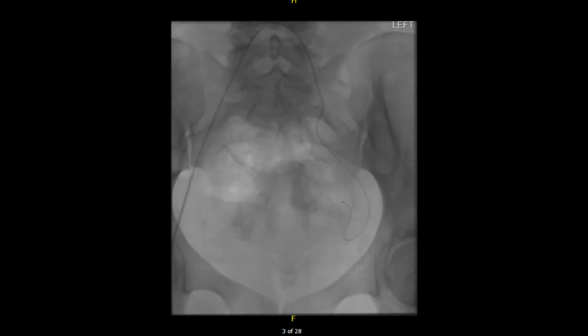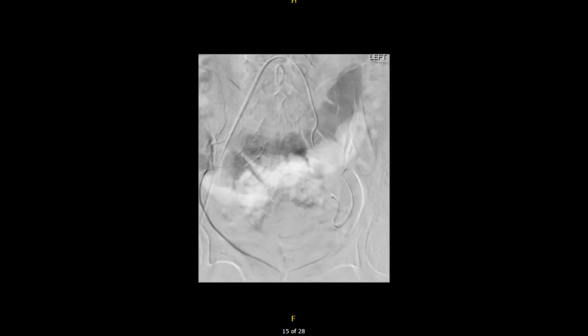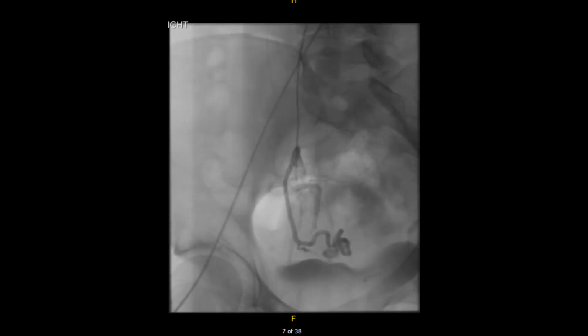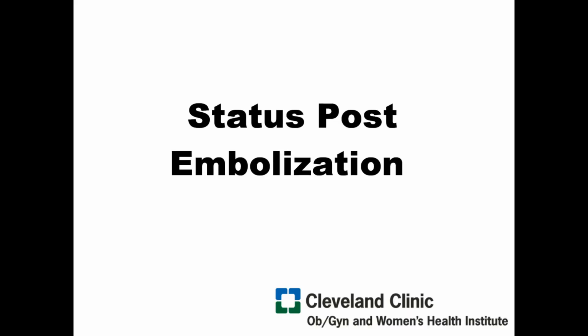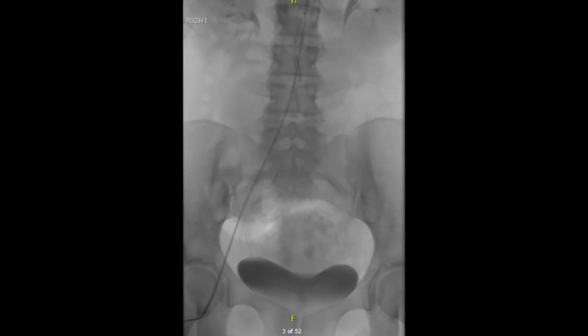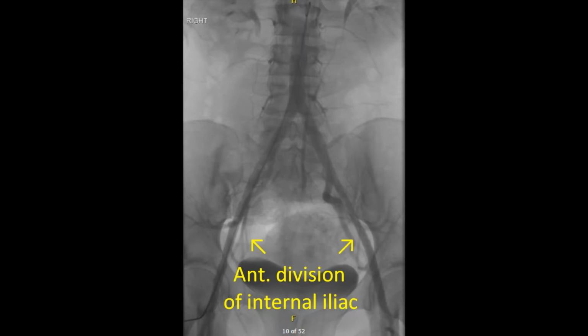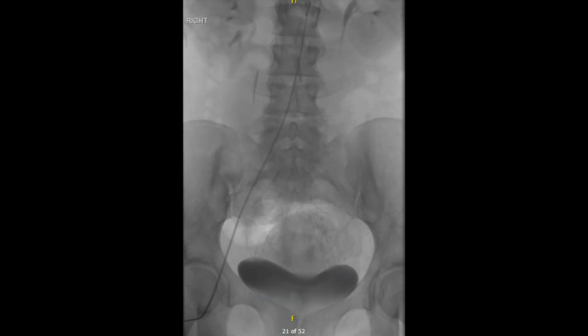An angiogram demonstrated bilaterally enlarged tortuous uterine arteries perfusing a hypervascular EMV, again confirming the diagnosis. Using 500 to 700 micron trisacryl gelatin cross-linked microspheres, each uterine artery was embolized to slow arterial flow. An angiogram following embolization demonstrated visualization of the main uterine arteries without visualization of the branches of the previously seen enhanced myometrial vascularity.